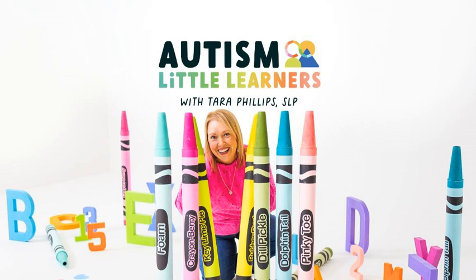When we embed AAC into daily routines in the classroom, therapy, and at home, we show students that AAC is real and a valid voice. We create natural, low-pressure opportunities for communication practice. We encourage independence and self-advocacy. And we have support from everyone on the team, teachers, paraprofessionals, peers, and families, to model AAC consistently. Let's take a look now at how to make AAC part of the rhythm of each day.